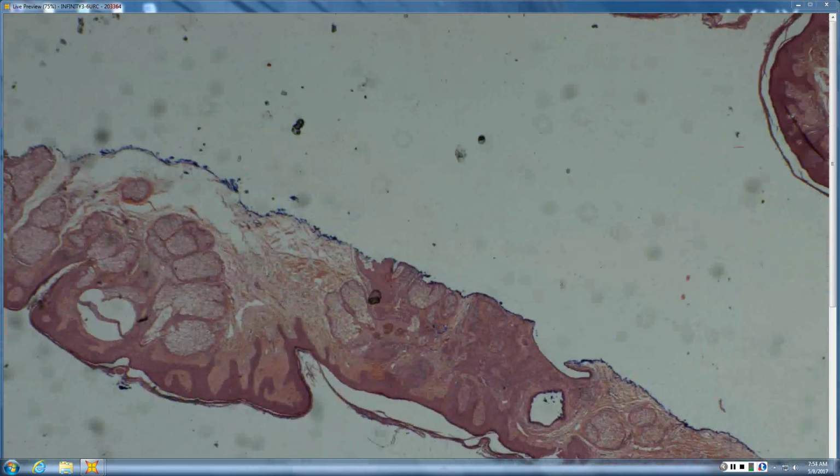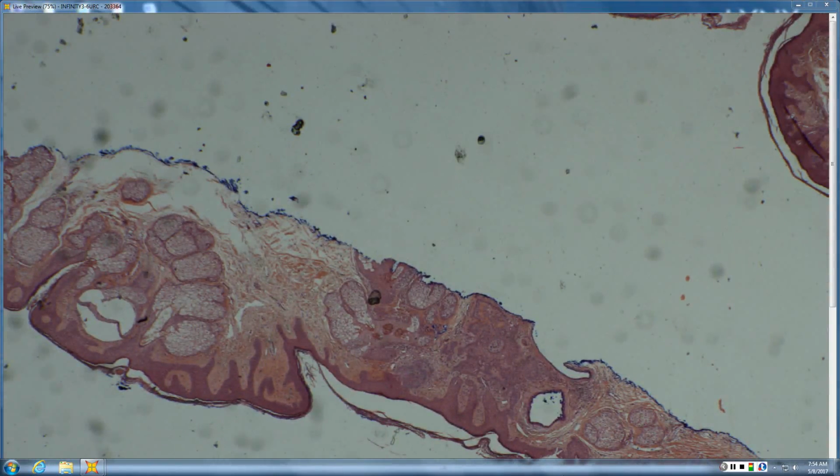So we have a shaved biopsy. This deserves applause. Well done. It's like sebaceous skin. So it's either sebaceous skin or that's part of the pathology. All right. What would the surface have looked like? Certainly sort of mammillated, maybe sebaceous stuff. You are right on.